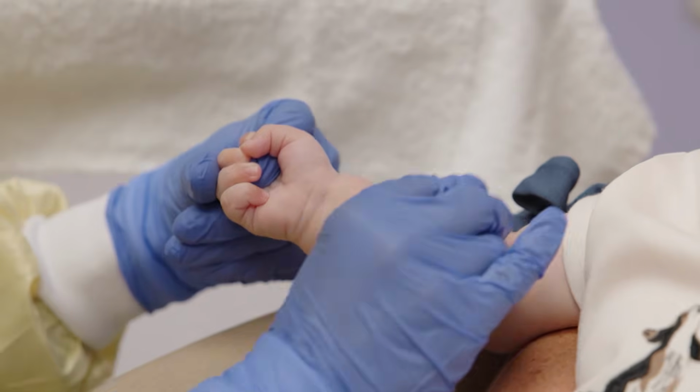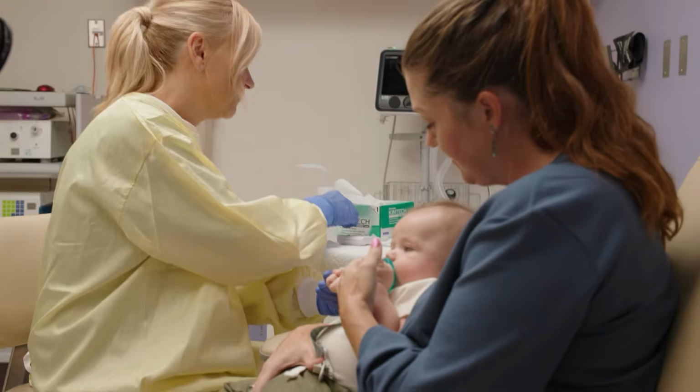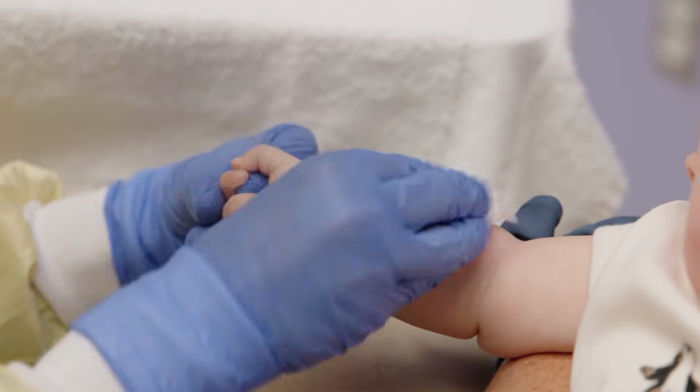The second electrode may be placed on the upper arm. If the forearm is not suitable, the thigh can also be used. Remember that both electrodes must be on the same side of the body to prevent the current from crossing the heart. Clean the skin vigorously with alcohol swabs and then rinse with CLRW and dry the skin.